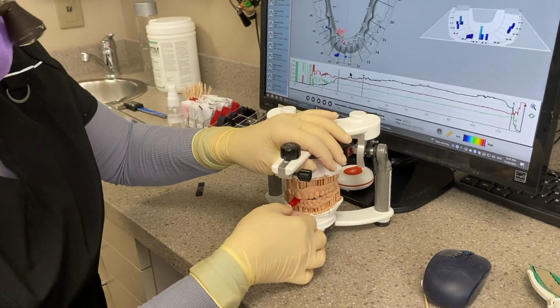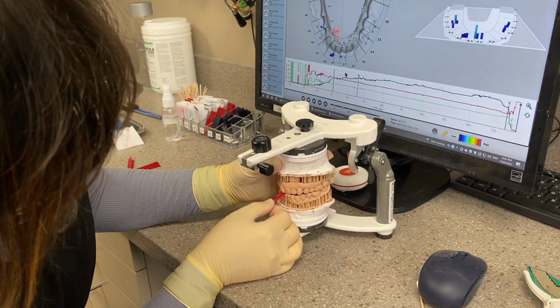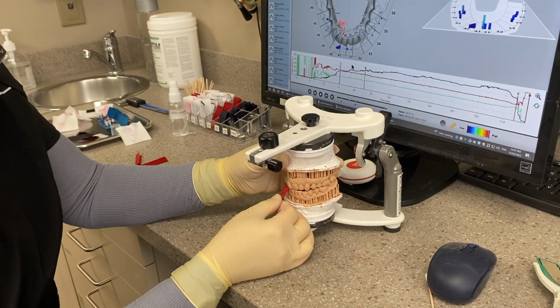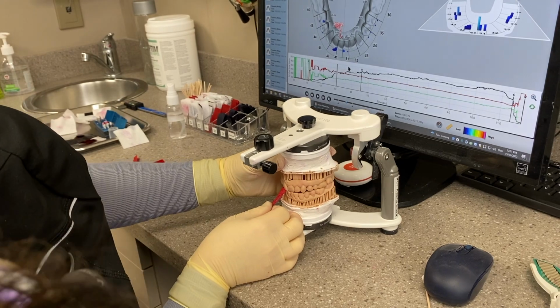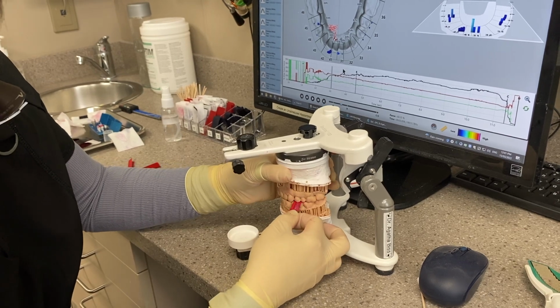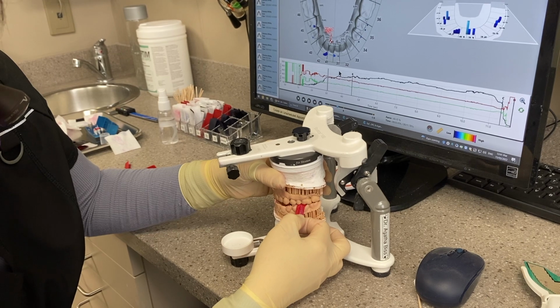Normally I wouldn't grind the lowers, I would actually want to open her up, but she is very open compared to her ideal vertical. So she actually does need to close up a little bit more still, which is why we're doing the equilibration. She's still heavy on the front teeth. Do I have any hope of getting her on the canine anytime soon? No. She's now back onto the bicuspids. So this is going to get into a more intense equilibration with her.